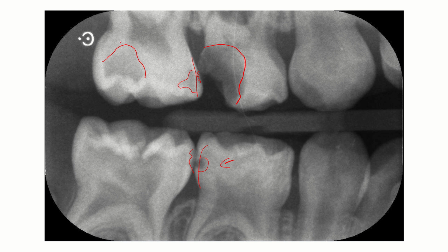Arguably there is still a band of dentine here, so we'd have accepted RC5 for that, but it's definitely there. And I'm not really sure why so few of you found that, because it is really quite an obvious one.